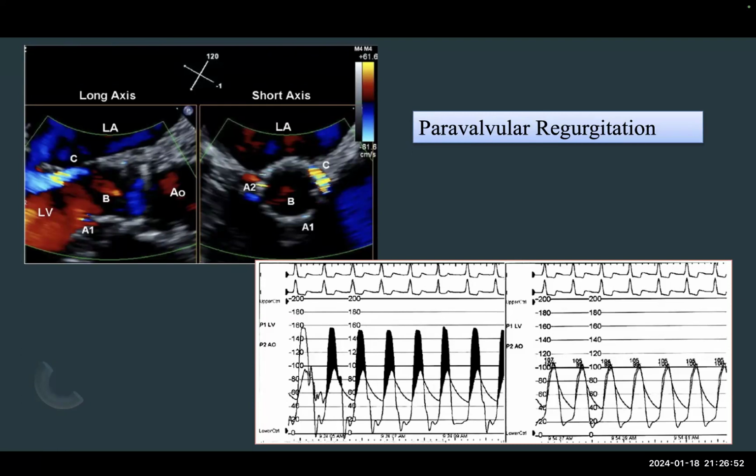Should we involve surgery in this situation? No, no. We can close it with a plug. Okay, a plug here. We put a plug here and close it. Do you know what a plug is? Yes, yes.